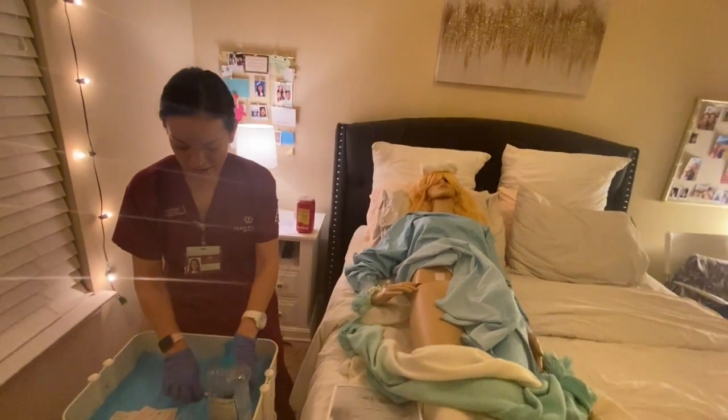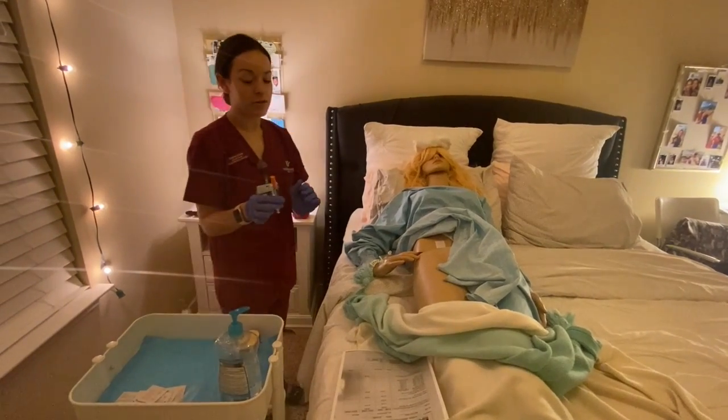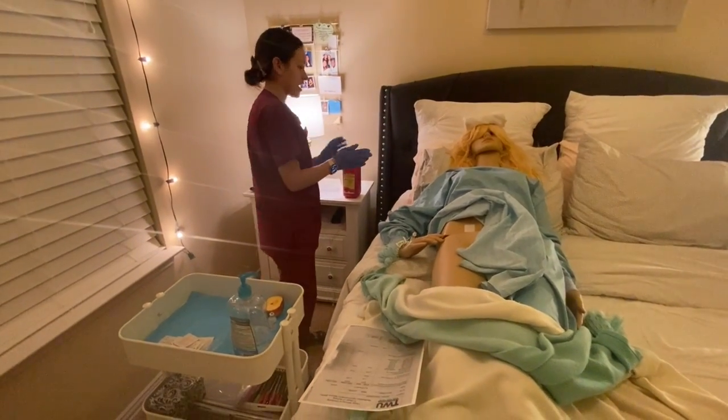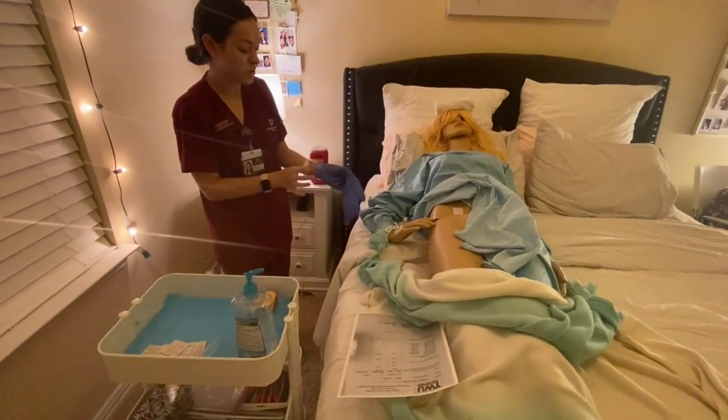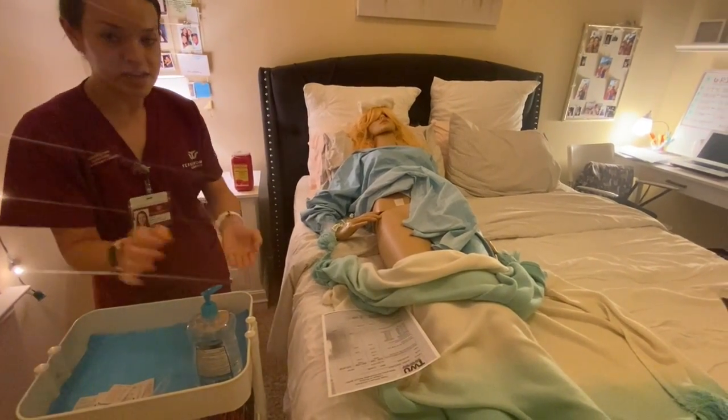I'm gonna do the same thing, scoop it, and discard in the biohazard trash. Okay, and I'm just going to remove my gloves and perform hand hygiene.